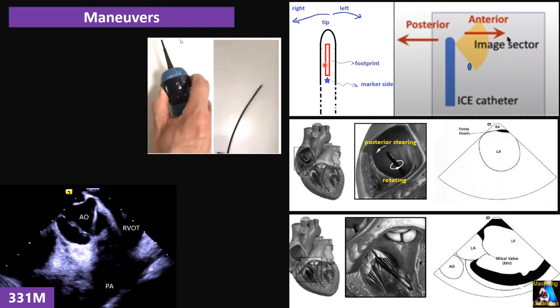Image D shows the intracardiac echo examination of the LV apex of a patient with an old anteroseptal myocardial infarction referred for VT ablation. The image demonstrates an LV clot in the apical aneurysm, preventing LV mapping of this area. The clot is pointed to with the red arrow.